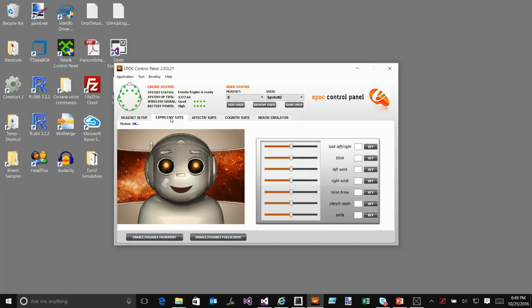The point I want you to take away from this is that it's actually recognizing, they have some algorithms that they wrote to try to recognize facial expressions. So what that means is that facial movement is actually picked up in EEG data. That's the takeaway I want you to get here, all right?